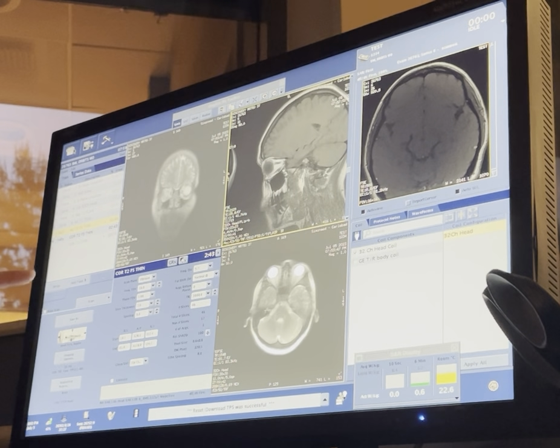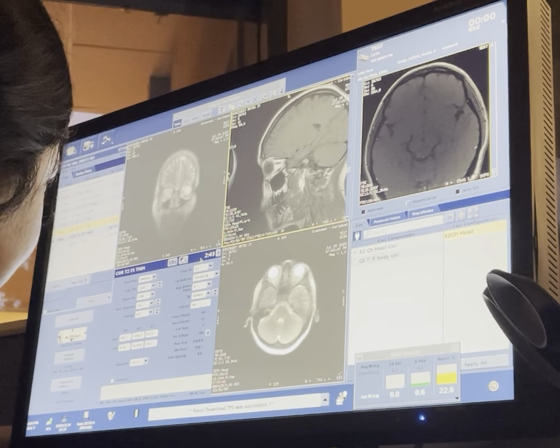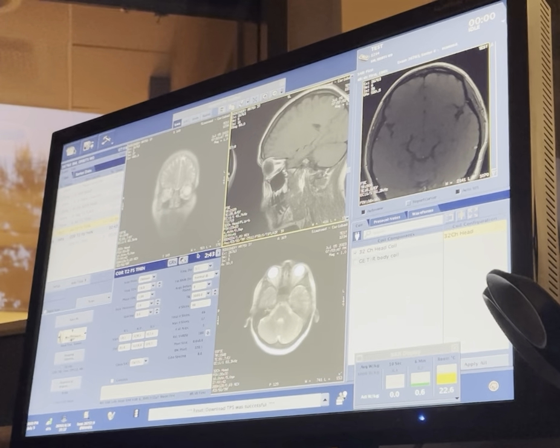Why don't you, hold on, why don't you just tell her this one's a minute and a half, and then click auto scan, because we're already in this other one. Hey, this next one is a minute and a half, okay? Okay, now click auto scan, and since it's saved, it'll automatically scan.